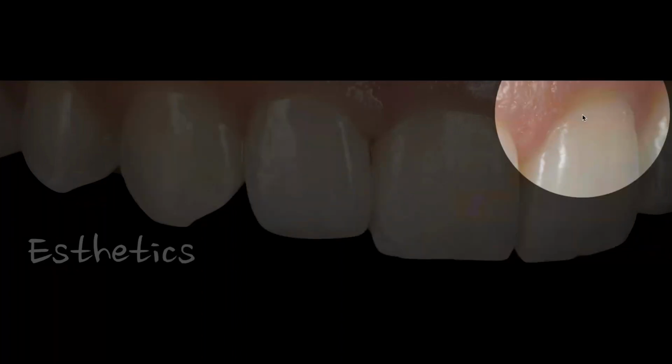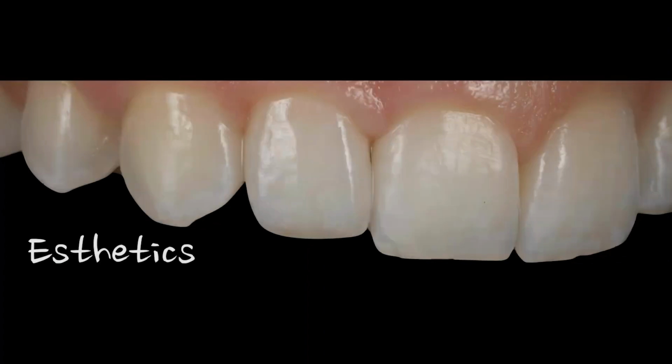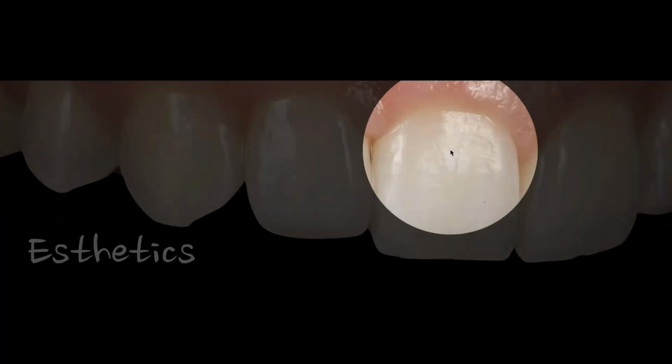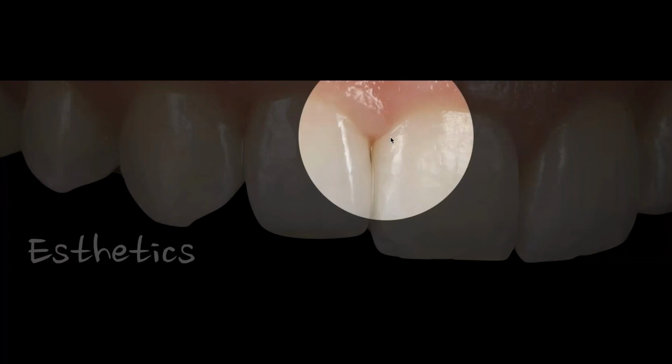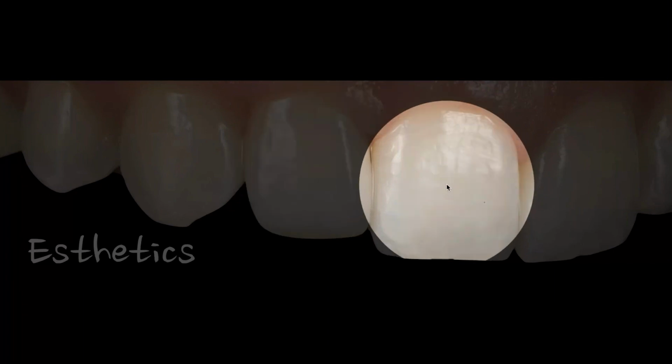You can see the line angle on the mesial of the number 9, so that's just the angle of the camera. Where is the failure here? The failure here is in the surface luster. I actually over polished this a little bit, and I think I over polished it trying to draw from memory, because I think I had a little too much surface topography and I wanted to polish a little bit out. So as I was working through my polish, notice the luster of the restoration here compared to the luster of the tooth here.